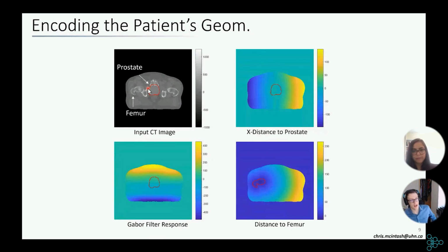We're also looking at, for future work, re-imaging the patient using MR technology and other types of imaging technology daily as they come in for their treatments, and then adapting those treatments to their daily changes in anatomy. Before, that wasn't really feasible because the patient would come in that morning, be imaged, and it would take a couple hours to generate the contours, a couple hours to generate the plan, et cetera. It wouldn't fit in time. But with machine learning making everything more efficient, it starts to become practical.